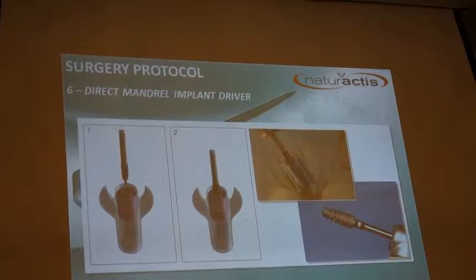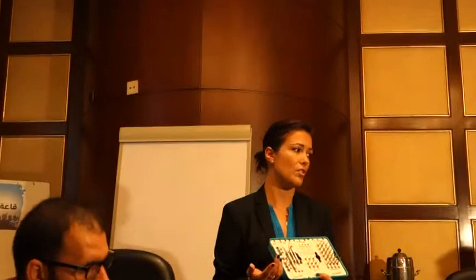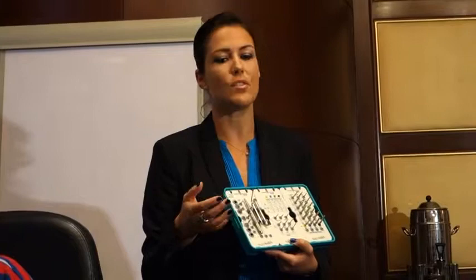You can use a dynamometric key to monitor the insertion torque. It's very important to place the implant at the recommended torque. From 35 Newton, you have good primary stability and can even do immediate loading. Under 30 Newton, primary stability is insufficient — it's better to place a cover screw, close the site, and wait for osseointegration without disturbance.